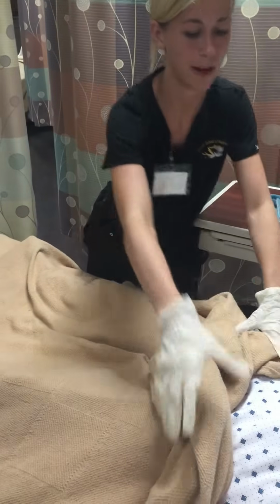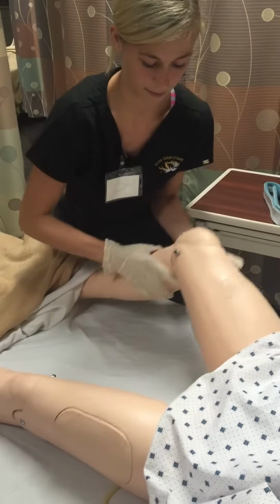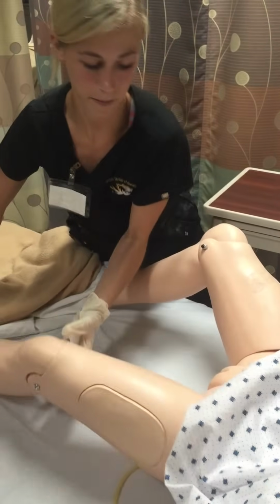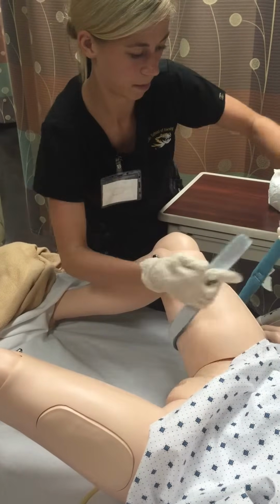Hi, my name is Jane. Okay, well, I'm going to go ahead and get started. Can you verify your name and date of birth for me? Okay. And do you have any allergies to latex, betadine, tropical fruits, shellfish? No. Okay, so today we're going to be continuing.